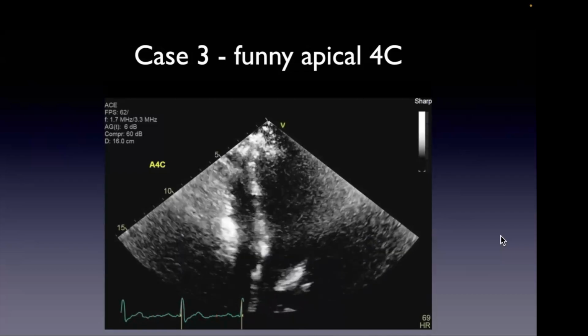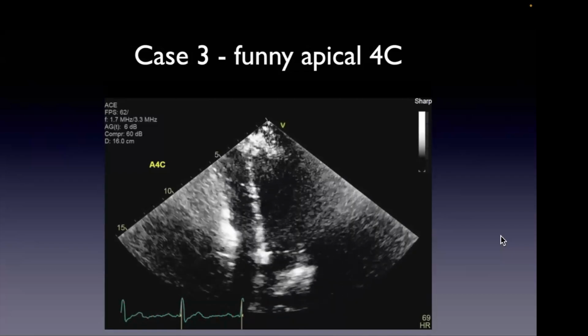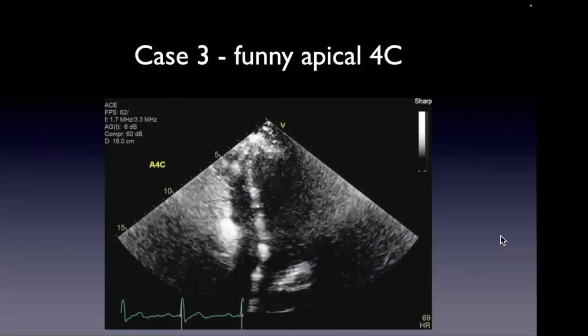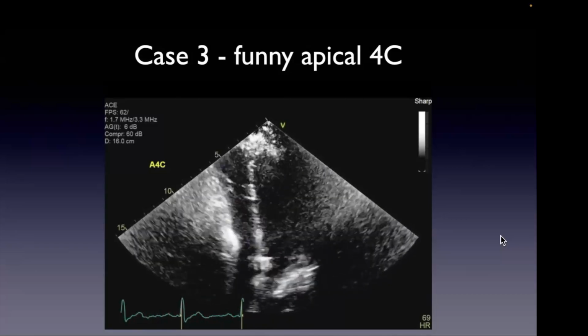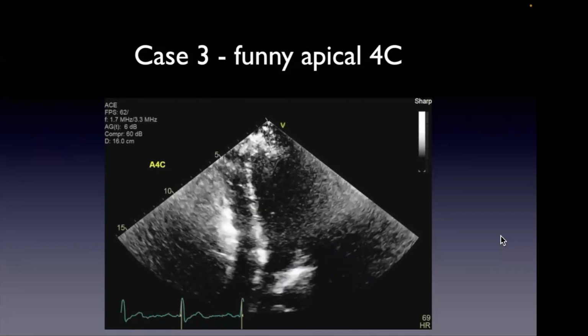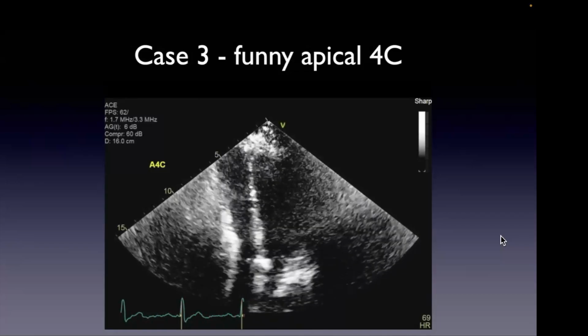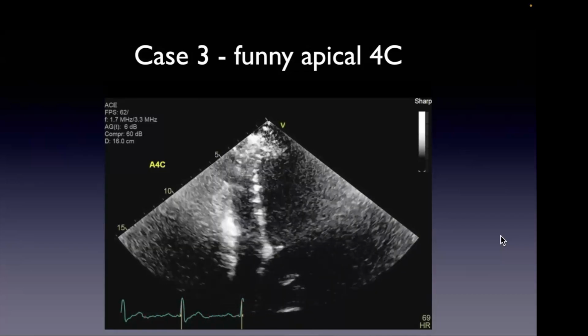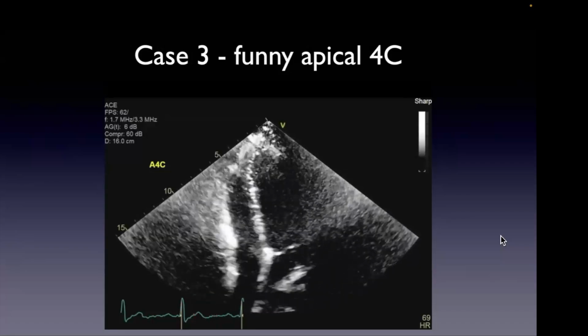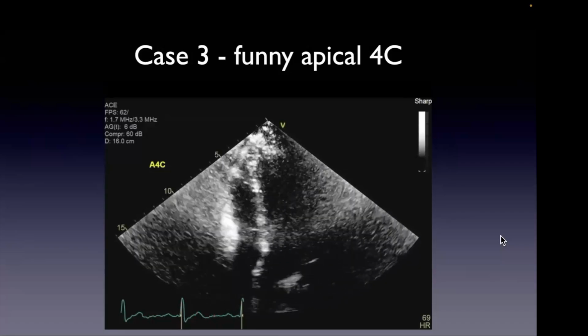Okay, but hernias are generally on the inferior part, right? So now you guys know this because you're scanning and you can tell. The patient's in front of you, so you know this particular abnormality that can be associated with other cardiac abnormalities. So what's that called? I just lost it. Pectus excavatum. Yes. So this is a patient with pectus, right?